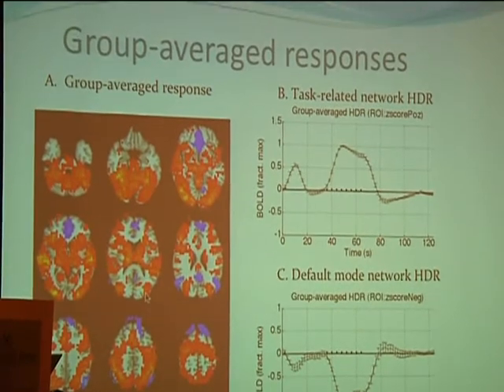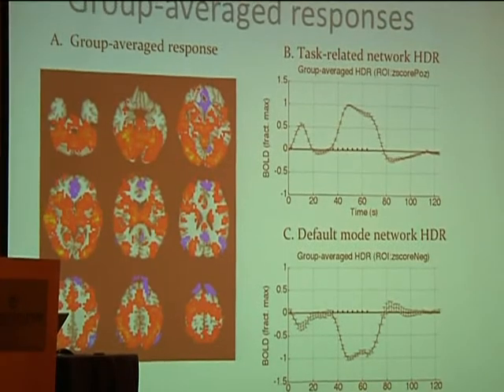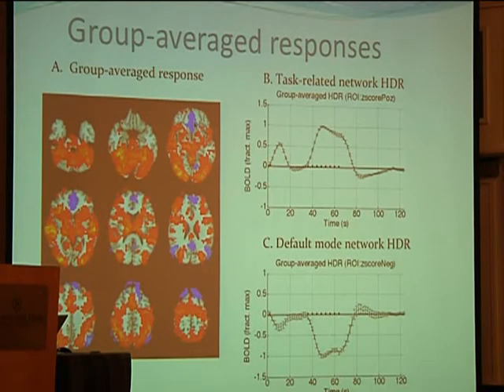signal in those regions. But in parallel, there was a set of areas shown in blue here, which actually decreased the responses. And it's a known phenomenon. Actually, it was discovered about 10 years ago. Brain imaging people discovered that there's a very well-determined replicable subset of cortical areas which always are suppressed when people pay attention to the outside world.